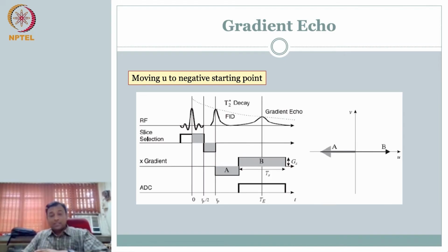Remember, distinguish this from the spin echo that we did. Fundamental difference. The echo, there also it was the same idea, right? It was dephasing, you made it rephasing, you got the echo signal, so we called it echo. But that rephasing started because of applying an RF pulse that flipped by 180 degrees. Clear? So your dephasing was happening because of spin-spin interaction. Okay. Whereas here the echo is coming because I am changing the magnetic field, not because of spin-spin interaction. I am actually changing the magnetic field.